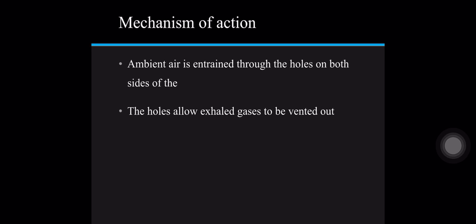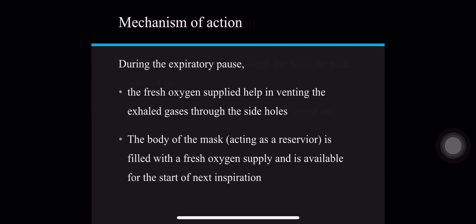Okay, next is the mechanism of action. From the side holes, ambient air enters and dilution of the fresh gas supply occurs. The holes also serve to vent the exhaled gases out. There is an expiratory pause in the normal physiology of respiration.